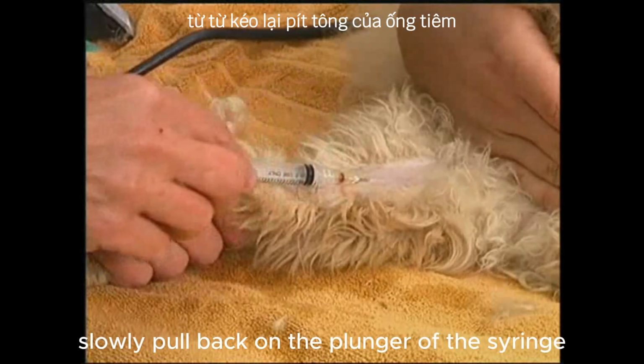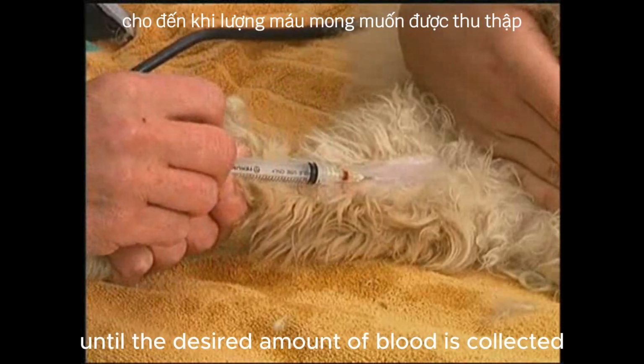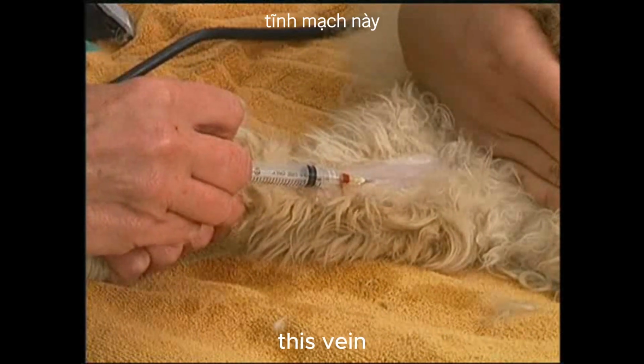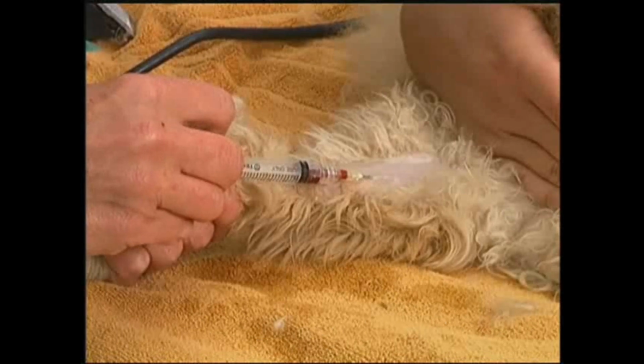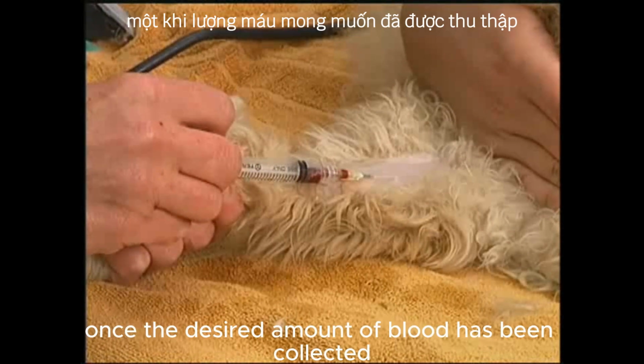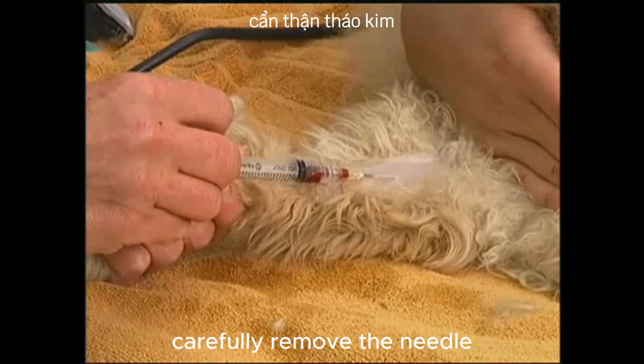Slowly pull back on the plunger of the syringe until the desired amount of blood is collected. This vein typically allows you to collect up to 3 cc's of blood. Once the desired amount of blood has been collected, carefully remove the needle.